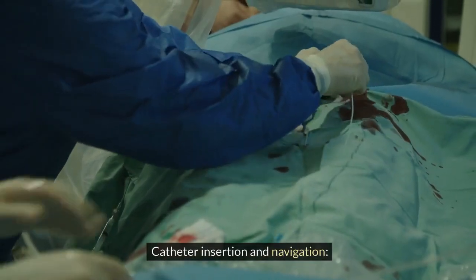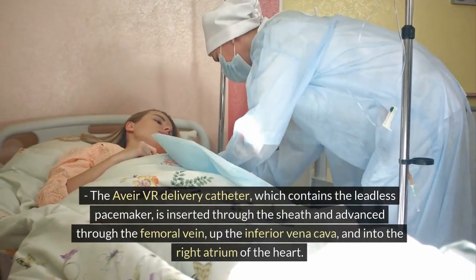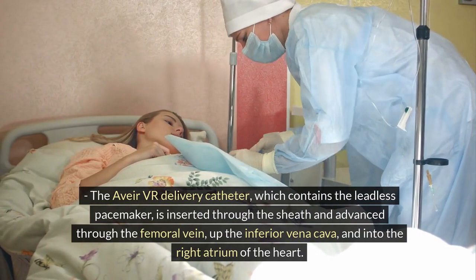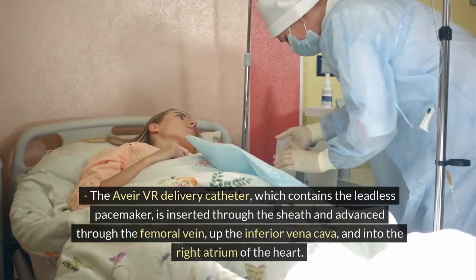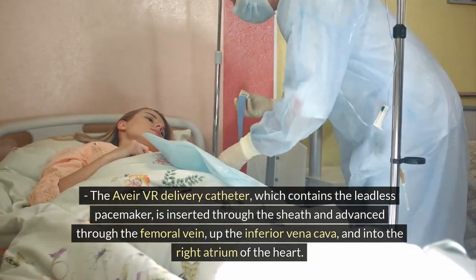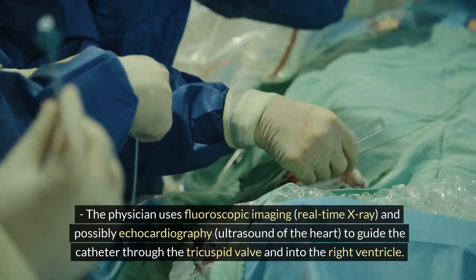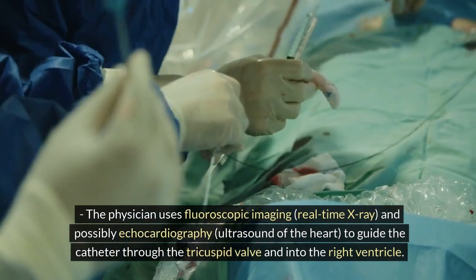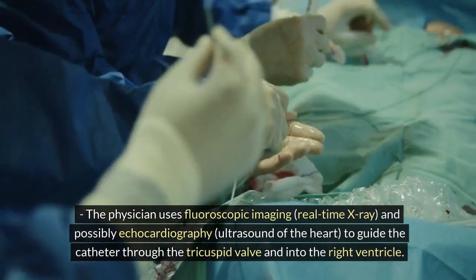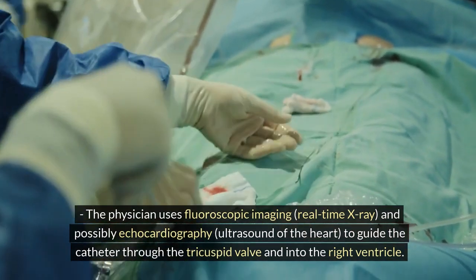Step 3: Catheter insertion and navigation — the Avia VR delivery catheter, which contains the leadless pacemaker, is inserted through the sheath and advanced through the femoral vein, up the inferior vena cava, and into the right atrium of the heart. The physician uses fluoroscopic imaging (real-time x-ray) and possibly echocardiography to guide the catheter through the tricuspid valve and into the right ventricle.